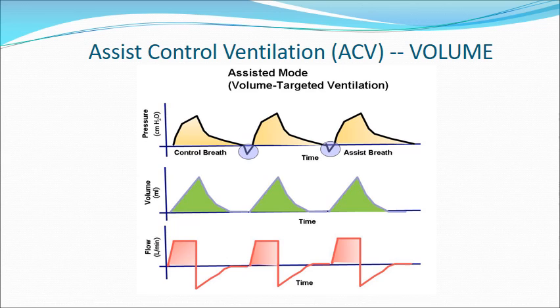So it looks for a negative pressure trigger, and then it will force an additional breath into the patient. So if the patient wants an extra breath, they get an extra breath. However, the patient can be unconscious and the breaths will be delivered at a constant flow during inspiration at a regular interval that is set by the minimum respiration rate.